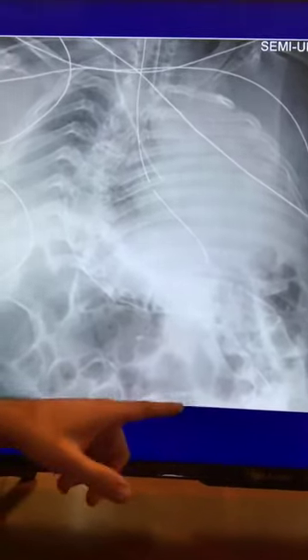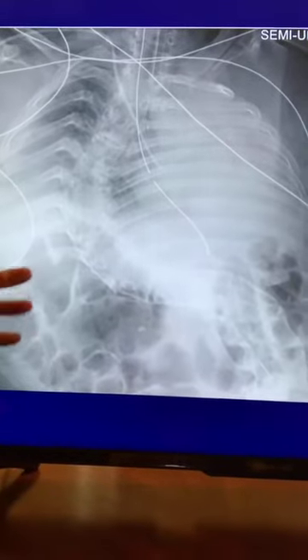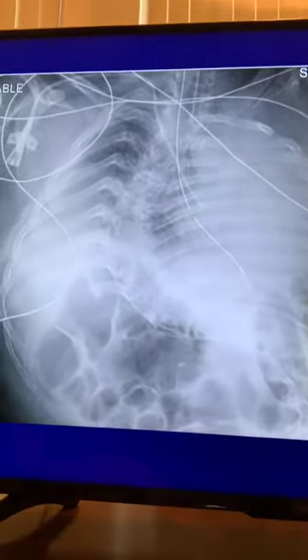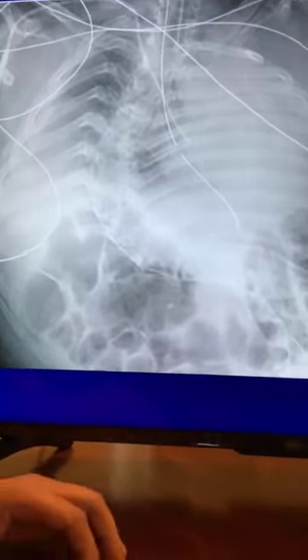I see a lot of small bowel loops. I see large bowel loops. We don't need to go into it again because you guys are experts now on the difference between large and small bowel, right? You guys can review that. But yes, the next case that I want to go into, let me see, I have it on this side, is this guy right here.